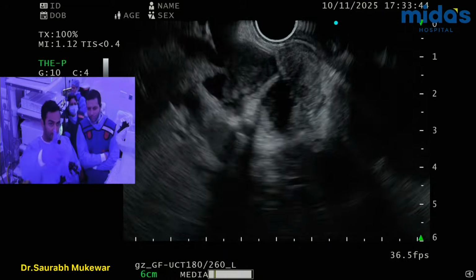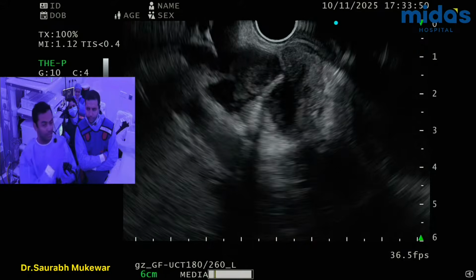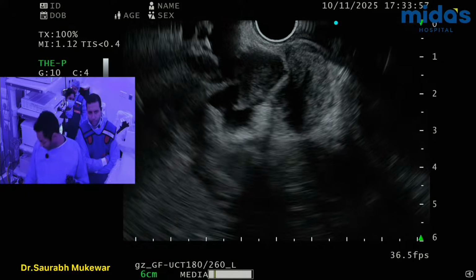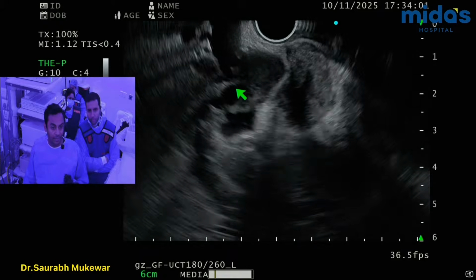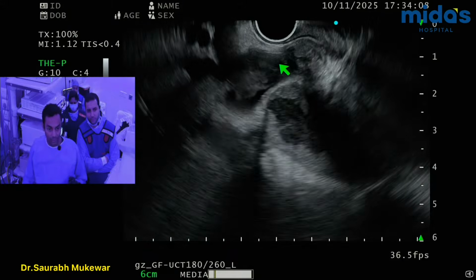And if I hit the duct here, then I'll potentially block one of the systems which I don't want. So this is a lovely angle, but I might find an avascular window, right? So it's lovely. I can do it. Not a problem. So I could go from here, get the stent in, but then if stent is here, then this will get blocked because you're using a covered stent. So I can't really go, I don't want to go here.